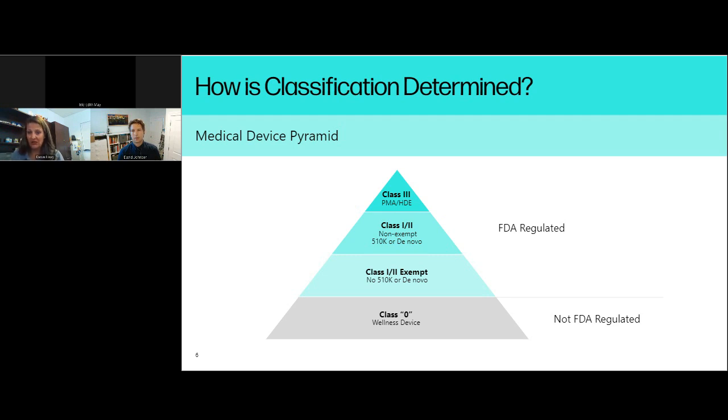When we have additive parts, now you can manufacture complicated and complex geometries. There's a lot of science around having a titanium end plate on your device for bony ingrowth, so that's a benefit. But when we start doing mechanical testing, we're looking at how the failure modes change on a static aspect. How do we hold the devices and not cause failure with the test block? We've actually had to change our entire mechanism for holding medical devices so that the test blocks aren't causing failures. That's not something we've had to do in the past for subtractive devices. And we have to do a lot more evaluation of what kind of failures happen, or whether it was something that actually existed in the device before testing happened.